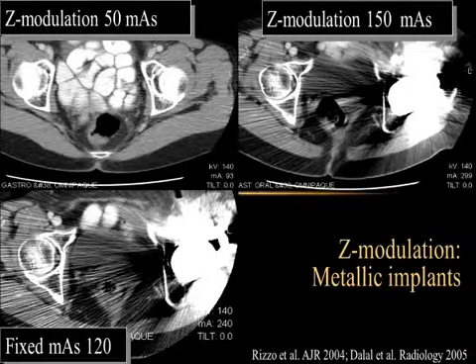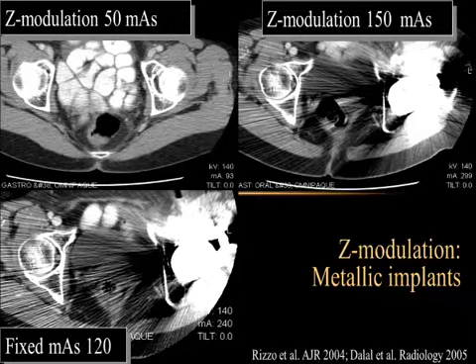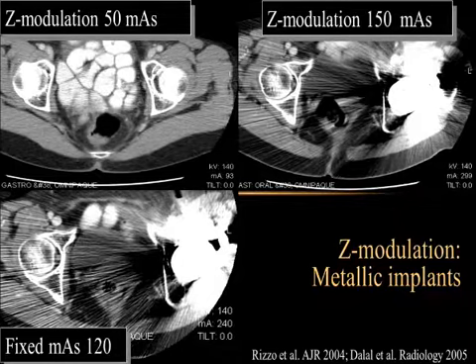Metallic prosthesis, again with automatic exposure control technique. Previous speaker, Dr. Mark Supanich, actually pointed that out very clearly, that when you have metallic prosthesis, you may have to trim the maximum mA that you can apply with your AEC technique. Some vendors, like Siemens and Philips, you do not have to do that. A, you cannot do that in many of their scanners, and B, you do not have to do that because these vendors have identified the problem.